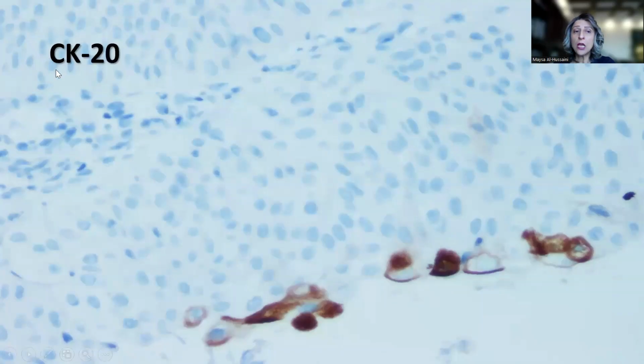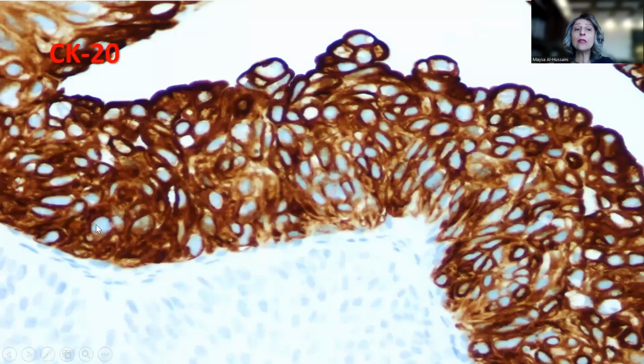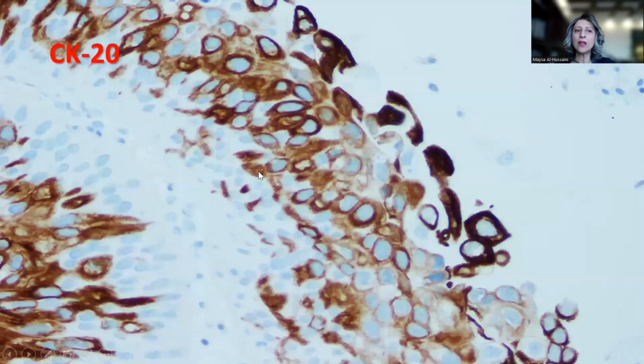Now, sometimes with cytokeratin 20 in the low-grade component, you might encounter the umbrella cell layer, which is normally positive with cytokeratin 20, but that does not make it a high-grade component, whereas in contrast, the higher grade component shows full thickness positivity with cytokeratin 20, strongly supporting the difference between both components on both sides of the fibrovascular core in the same papillae. Quite an unusual case.